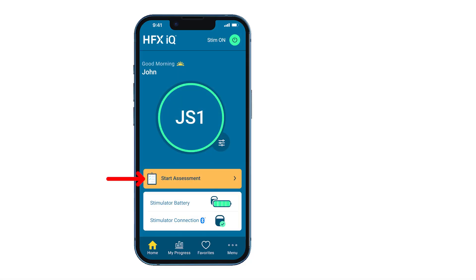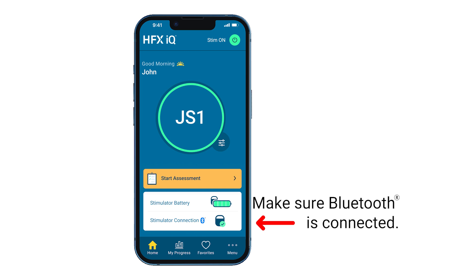Now we'll go through how to complete an assessment in the HFX app. It's important to note you will be prompted to take an assessment during the assessment window you chose with your Nevro HFX Care Team. You will know you're in your assessment window when your Start Assessment icon is yellow. Assessments done during this time frame will allow IQ Mode to either recommend a change to your setting or encourage you to stay on your current setting.